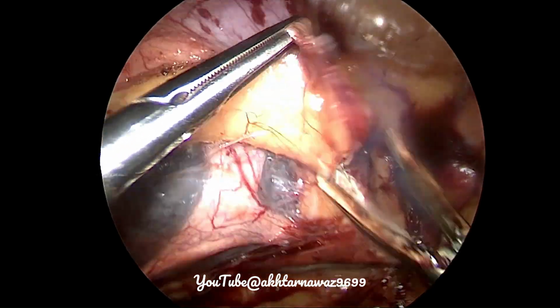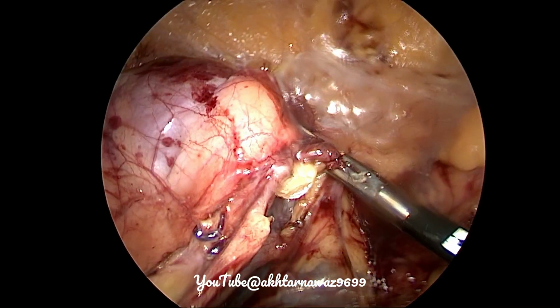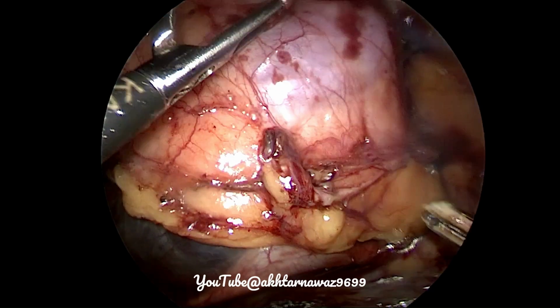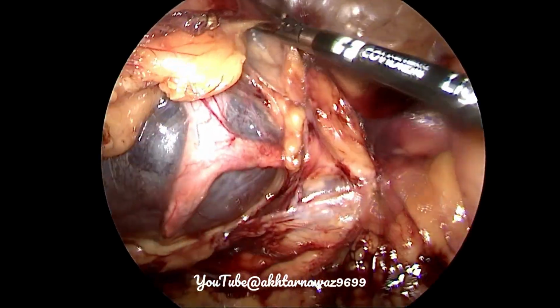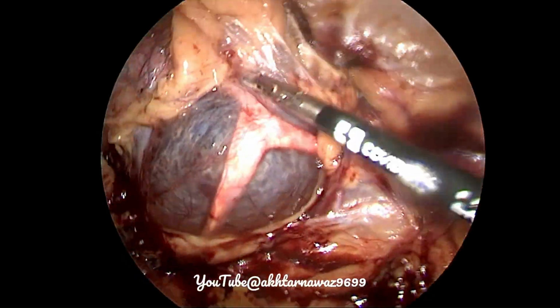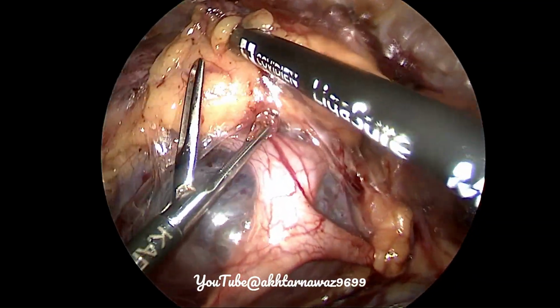So here you can see that now the middle calyx is in picture. The pointer will be now showing, after the dissection, the middle and the lower calyces. Yes, this is the middle calyx. The yellow arrow is the lower calyx.